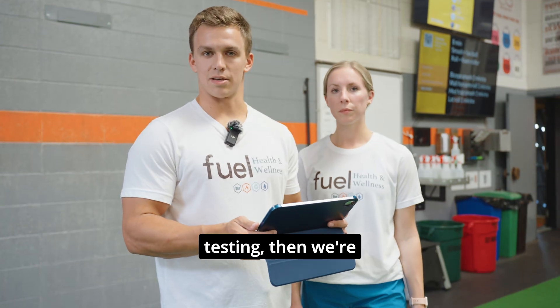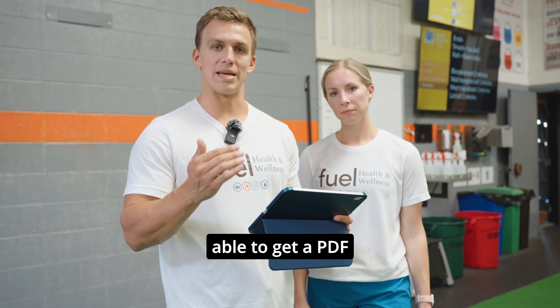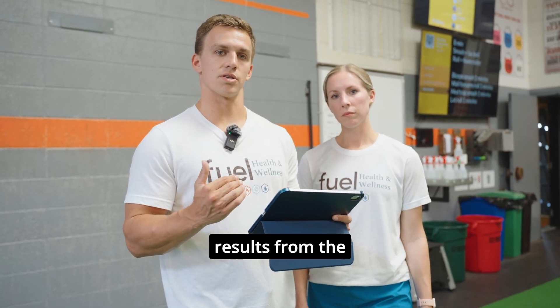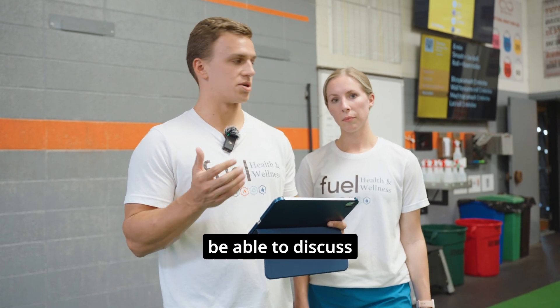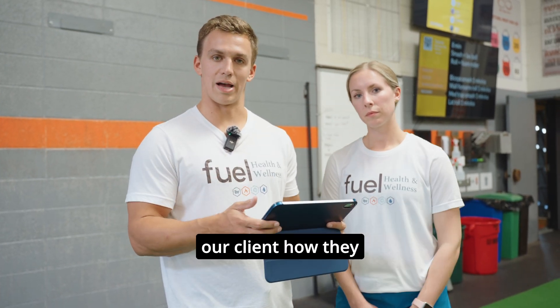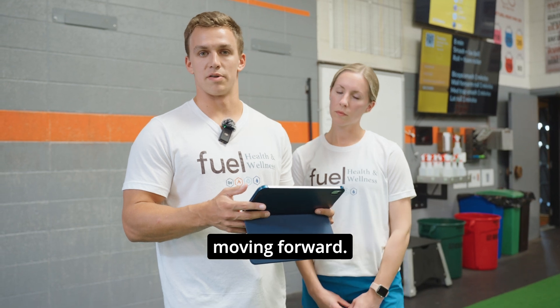After we get done with the testing, we're able to get a PDF breakdown of all the different results from the AMI testing and also the running, which helps us to be able to discuss with our athlete or our client how they can improve moving forward.